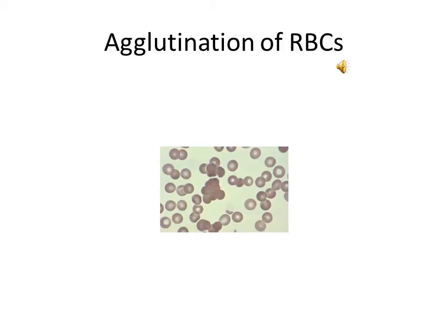Here you see a picture of agglutinated red blood cells. These can occur as a result of an antigen-antibody reaction within the body. We'll go into those cases when we get into blood banking. And also it can occur in cases of autoagglutination, which is a reaction of the patient's own cells with the patient's own plasma. In this case, if we're looking at an EDTA sample, these occur with cold hemagglutination disease and paroxysmal cold hemoglobinuria, which is known as PCH.